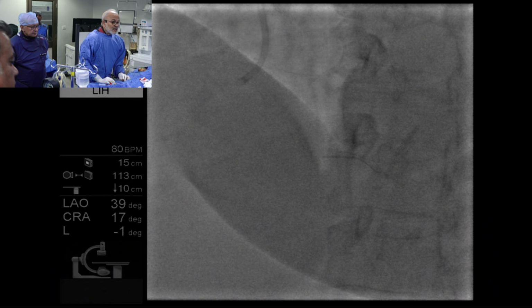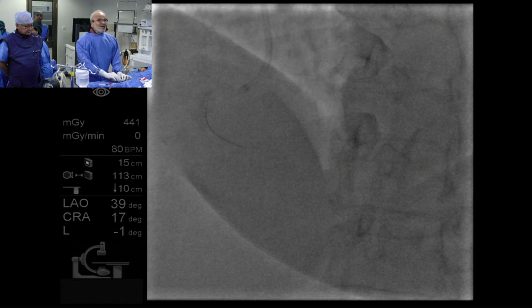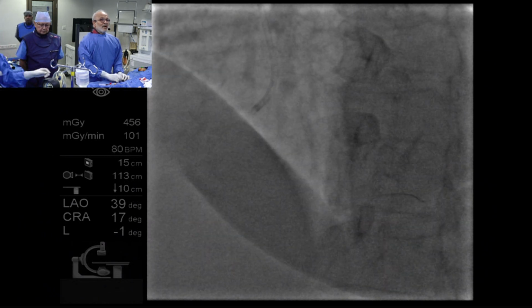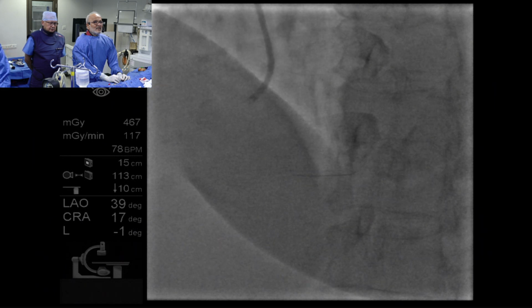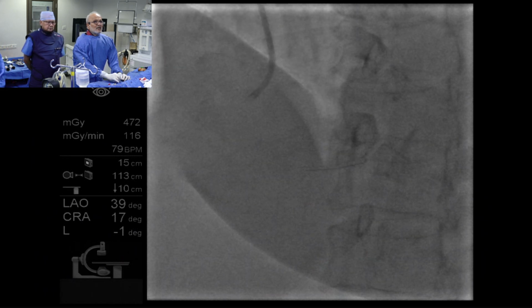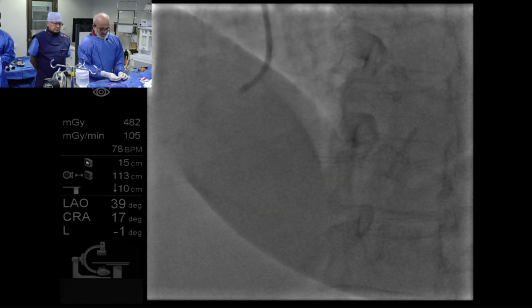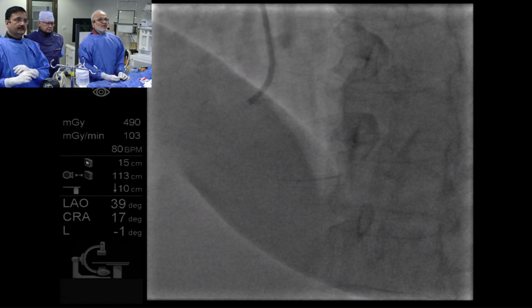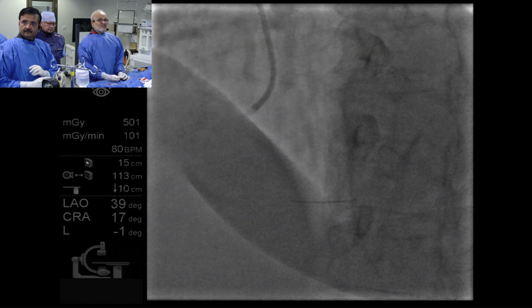That's it. Lovely. Now, here you always need 2 guys. A wire. Wait. No problem. I think it is PDA. No, it is an intermediate artery. Sanjay, I am taking a little back. Let me come out and go in. So, sir, are you planning to rotablate the PDA ostium as well? Yes, that is very important.